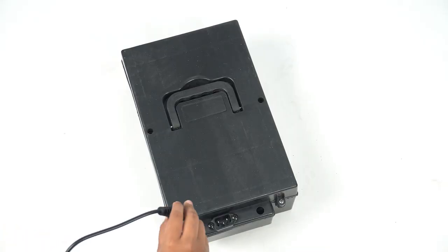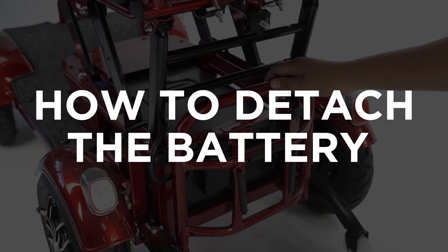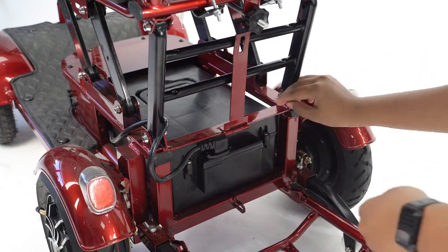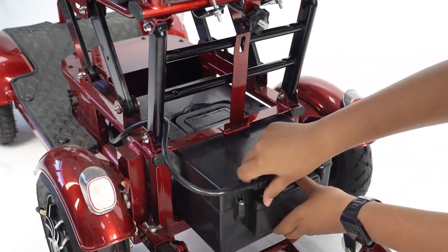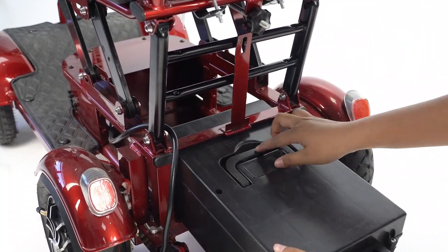Alternatively, you can also detach the battery from the device for direct charging. How to detach the battery: Pull the metal bar down, lift the metal latch, pull the battery out, and plug out the plug.